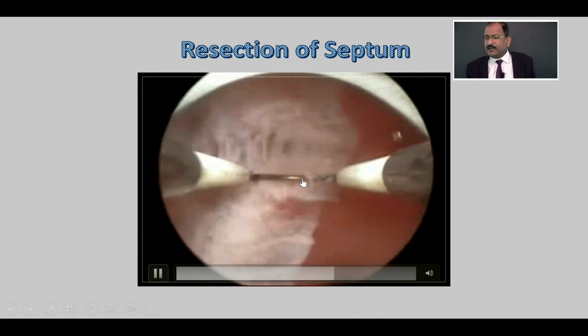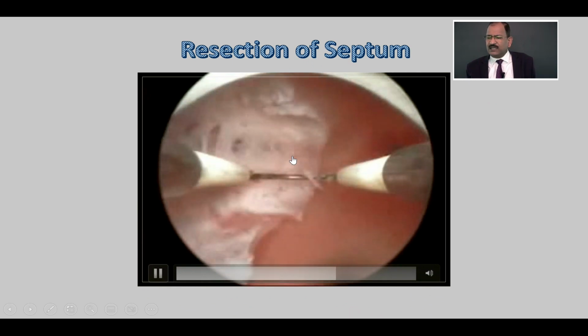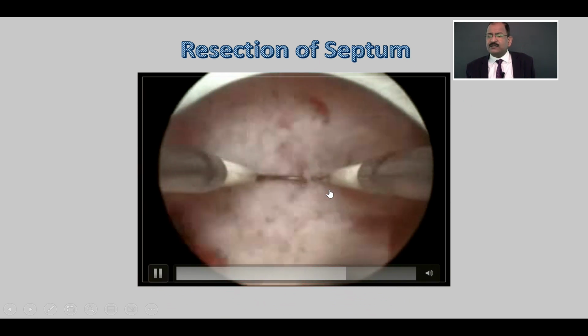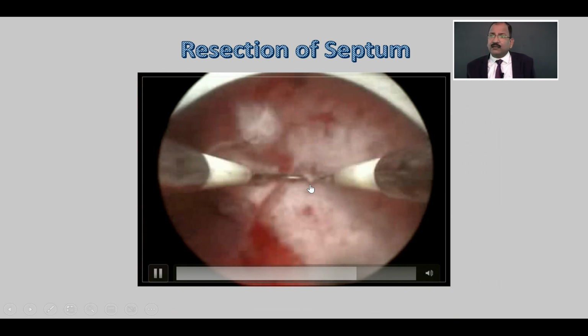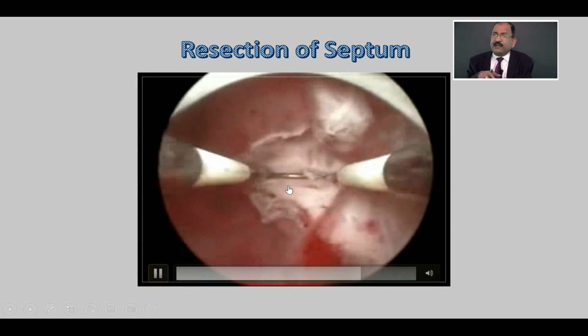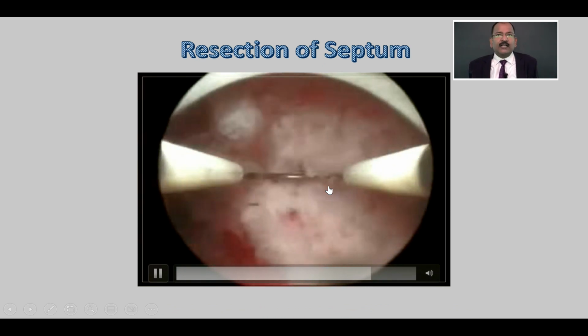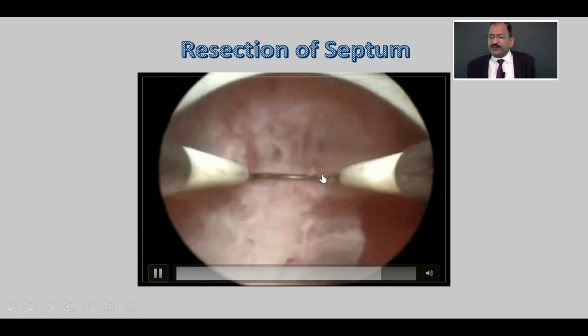After that, this side is still a little darker, this is a little brighter, here is the ostia. So again slowly, millimeter by millimeter, you will cut and stop. And that's all. You only have to cut it in the middle. In septate uterus, suppose this is the septum, you don't need to cut either side, only a split in the middle, that's all. It is already under tension, so it will go away. After that, put one IUCD and come out. So, this is a straight knife.